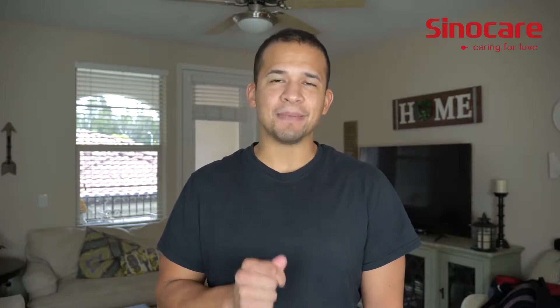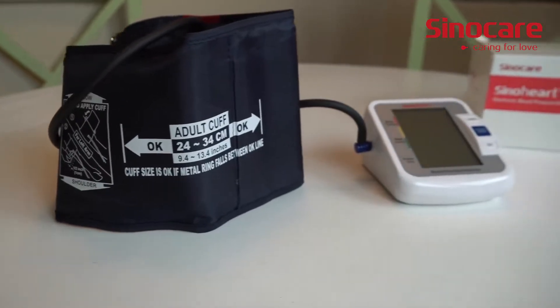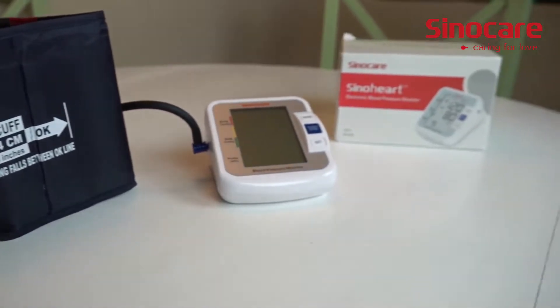Everything about the way this blood pressure monitor was designed was aimed to make it easy to operate, which is exactly what you want with an at-home blood pressure monitor. Let's face it, when it comes to at-home electronic blood pressure monitors, there's no other way to go.